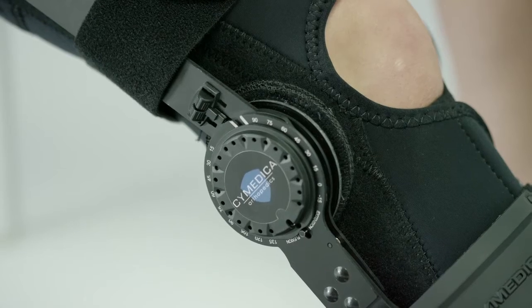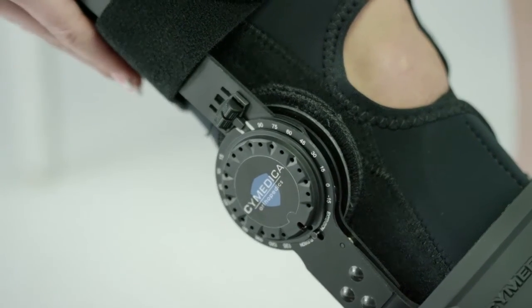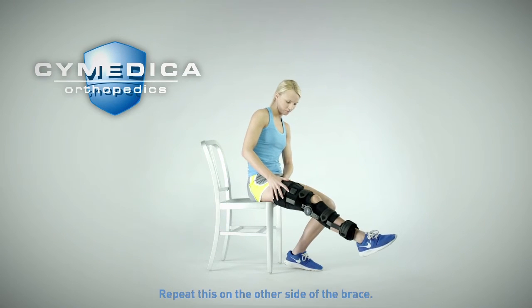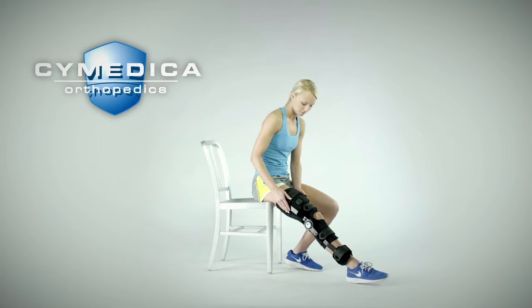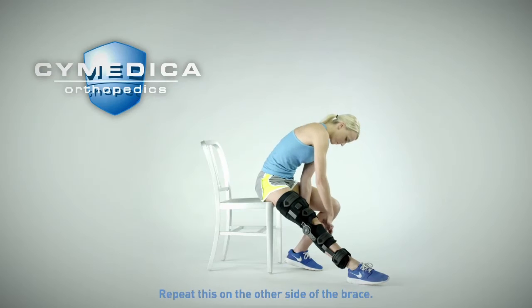Line up the tapered end of the slide lock between the white lines on the brace and push the slide lock down towards your ankle until it is fully seated. Repeat this on the other side of the brace. To disengage the slide lock, pull the slide lock upwards until fully disengaged. Repeat this on the other side of the brace.